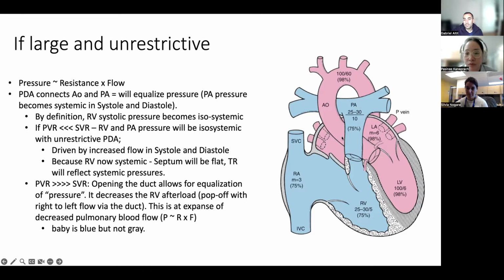Why? Because it means you need to puncture an artery, or you can do so by going through the foramen ovale. But if there's no foramen ovale, or if it's too tiny, imagine a little hole, they're trying to thread a catheter through that in the 3D structure of this wall, and they're not able to, and the catheter is flickering like this. So they're trying to access the left side if possible, but sometimes it's not possible.